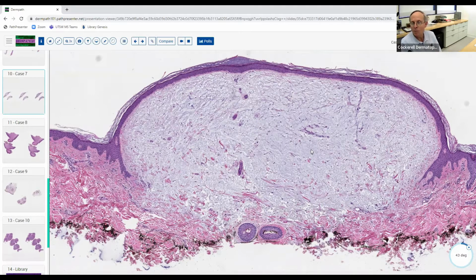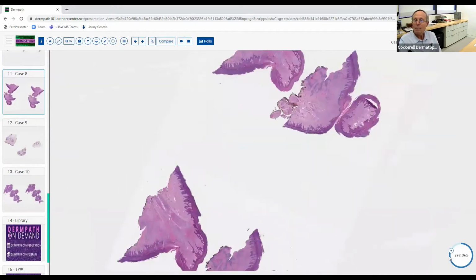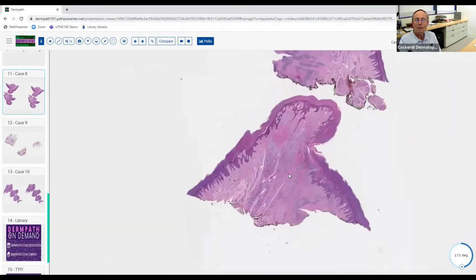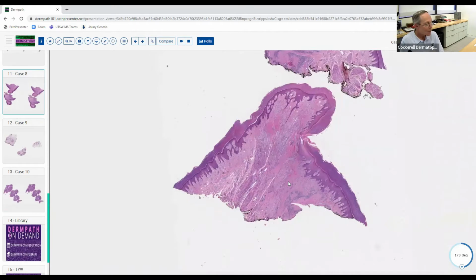There's the epithelial mucin produced by glandular cells that produce it and excrete it, like in your GI tract. And then there's this type of mucin that's produced in the skin here, for example. Any questions about that? Okay. Any takers on this one?